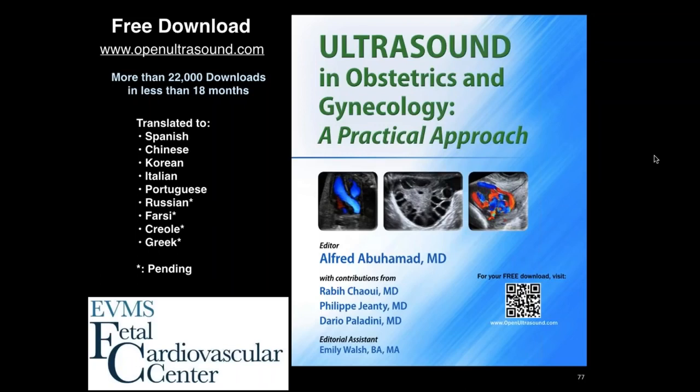But I could tell you that I'm hoping, and if you are, certainly you're committed to ultrasound and interested in ultrasound because you're on the webinar, we're going to be doing a lot more first trimester ultrasounds, I anticipate, in the next 5 to 10 years. And I anticipate that the first trimester ultrasound will play a much bigger role in our evaluation of the fetus, both from an anatomy point of view, but also from a functional and risk assessment point of view into the future.